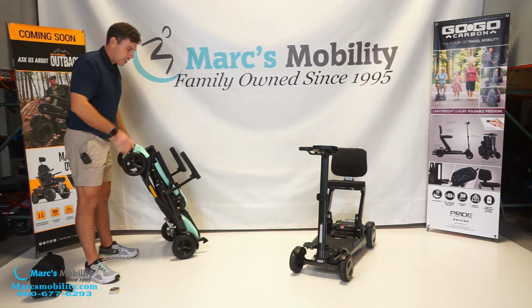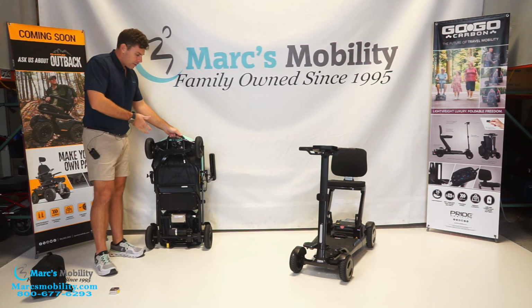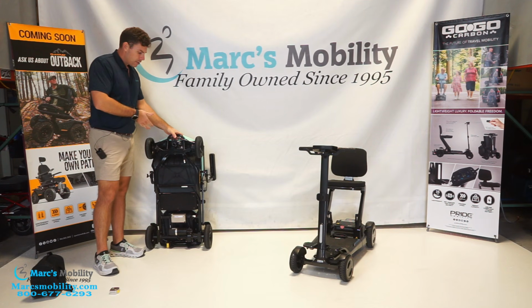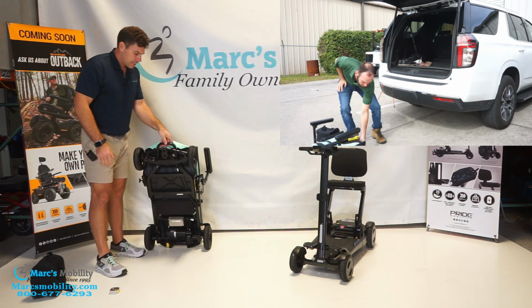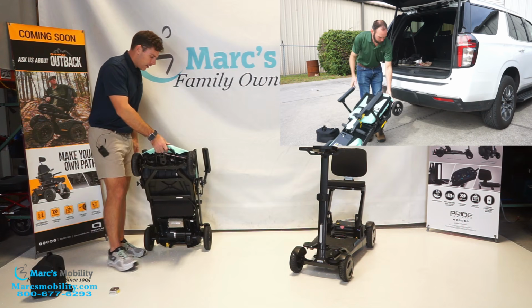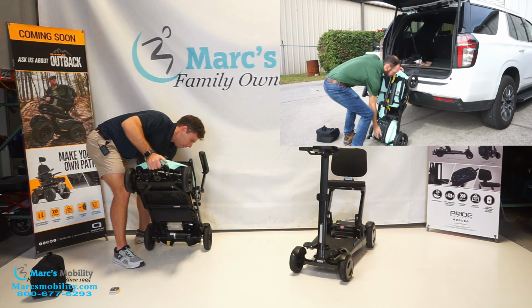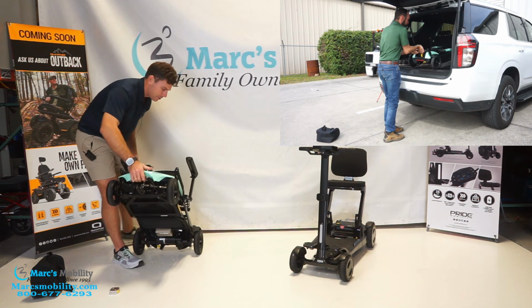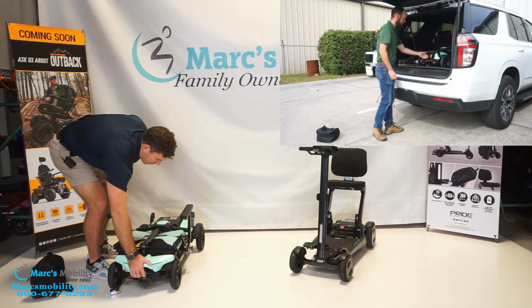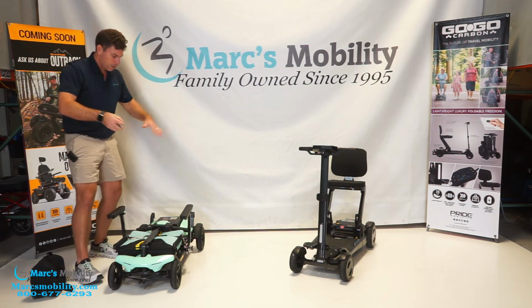But if you just need to move it a couple feet, once you have it by the back of your vehicle. And what I would probably mention too is when you're going to be loading this in the vehicle, something like this would be almost easier if you had an SUV and you had a blanket. You could pivot this onto the front of the unit, and then you can grab it from the back and lift it from the back and then pivot it into your vehicle. I'm going to go ahead and give you the dimensions. Most likely it's going to be sitting like this in your vehicle when you're loading this.